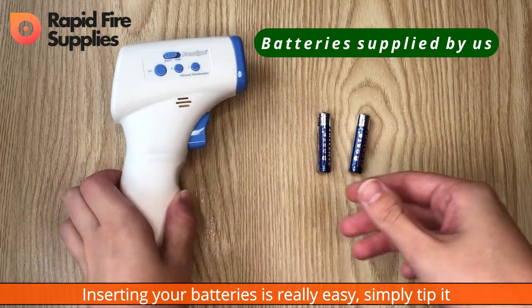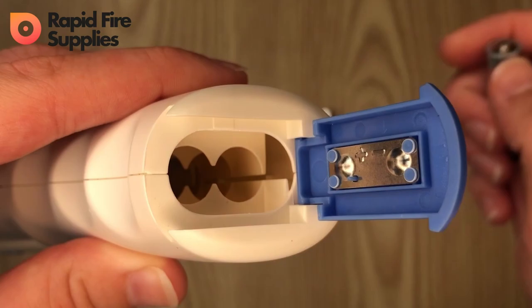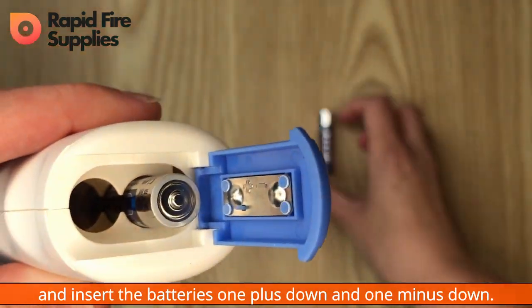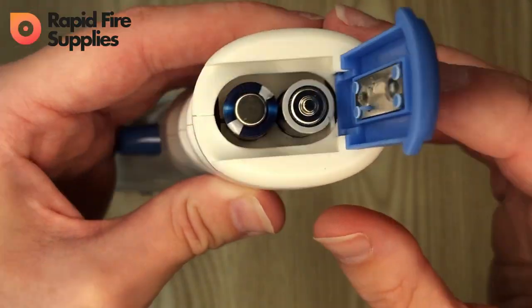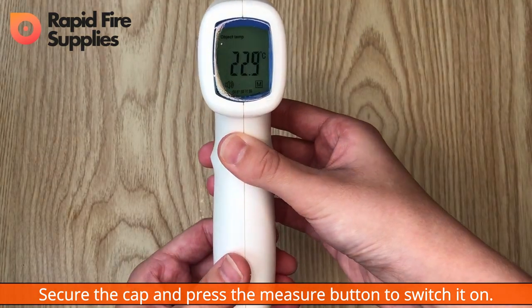Inserting your batteries is really easy. Simply tip it upside down, pop open the blue cap, and insert the batteries — one plus down and one minus down. Secure the cap and press the measure button to switch it on.